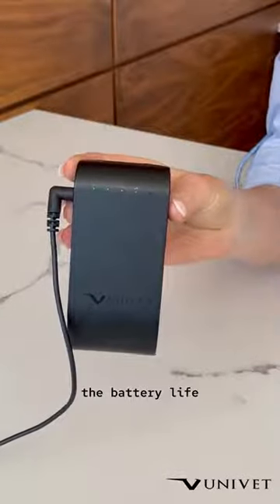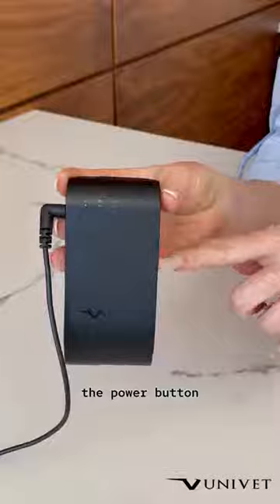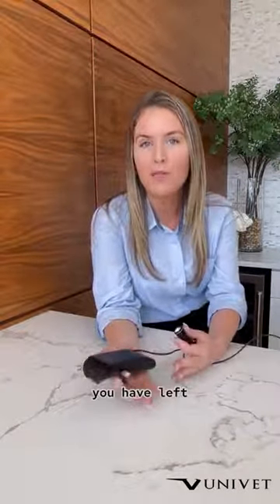To check the battery life, you just hit the power button on the side one time, and the green light here will show you the charge. Alternatively, you can open up the app and the app itself will tell you how many minutes you have left for your light.